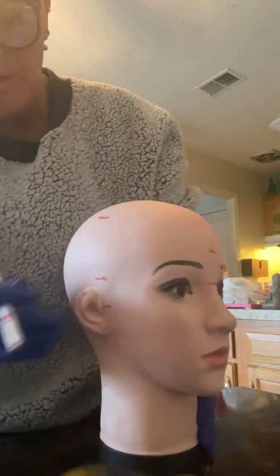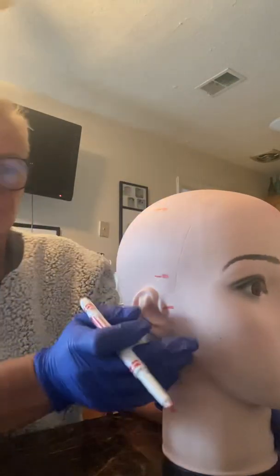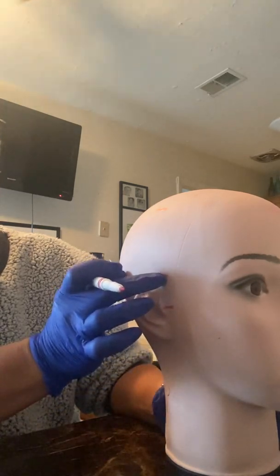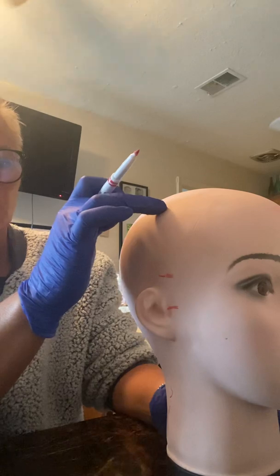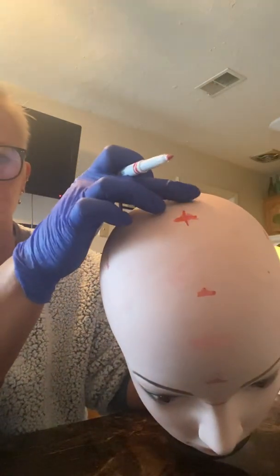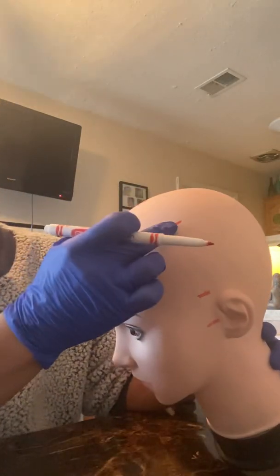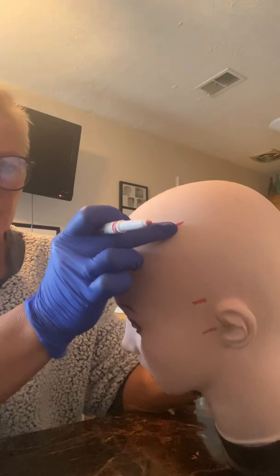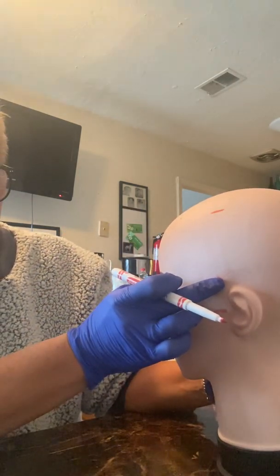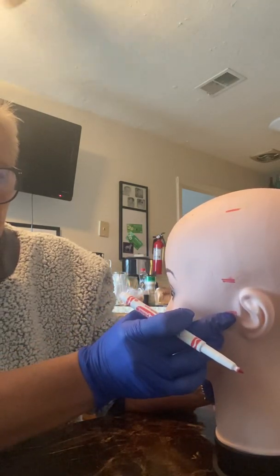So to recap: 10% from the right preauricular is T4, 20% up is C4, another 20% gives us our second mark for CZ, another 20% gives us our mark for C3, then another 20% for T3, and then our left preauricular.